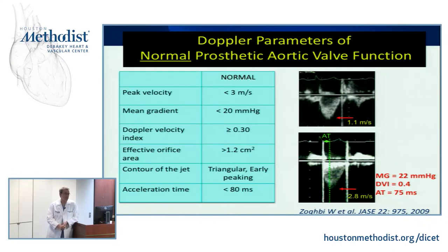Current generation surgical valves, like the Trifecta, which is one brand name, and Medtronic has another new one, are fundamentally different because they used to have the three posts and the leaflets would be inside the posts. So the posts would actually take up some of the flow area. So the mean gradient expectation would be around 15 to 20. Nowadays, the valves have the posts on the inside.